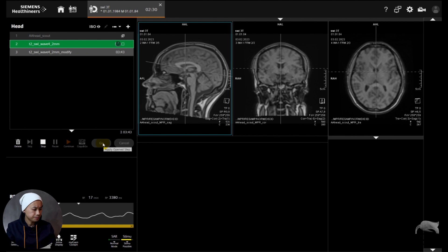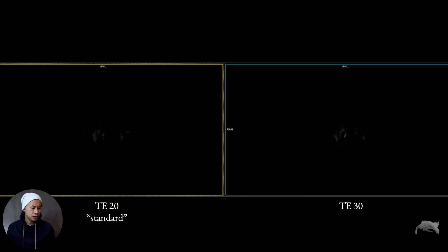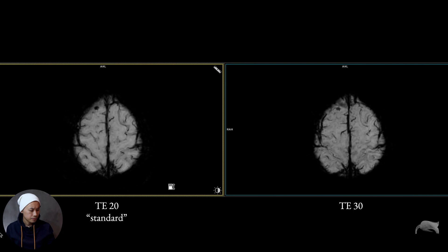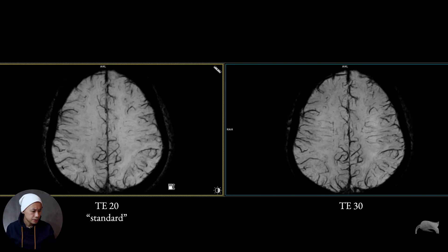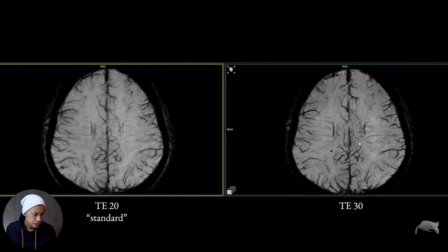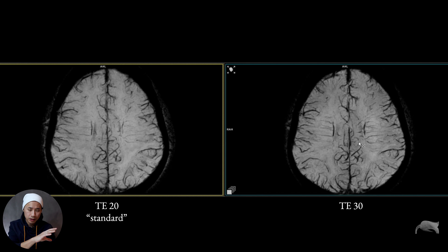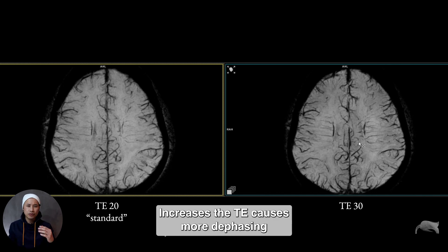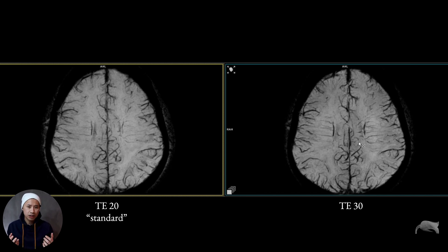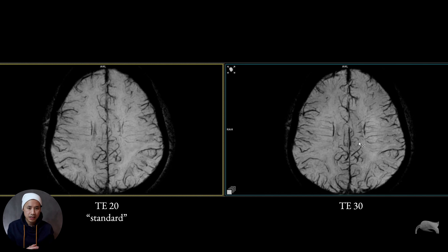So I'm gonna show you the results after the scanning. This is the results comparison head-to-head — on the left side is the standard one, on the right side is the modified one. You can see already here the differences: there are a lot more small vessels enhanced much better whenever you increase the TE from standard 20 to 30. You also see it's much more susceptibility — increasing the TE increases the susceptibility. That's exactly what we want to see: the blood, the artifact which we need whenever we use this sequence. It's more sensitive to blood, and that's why we're using SWI.